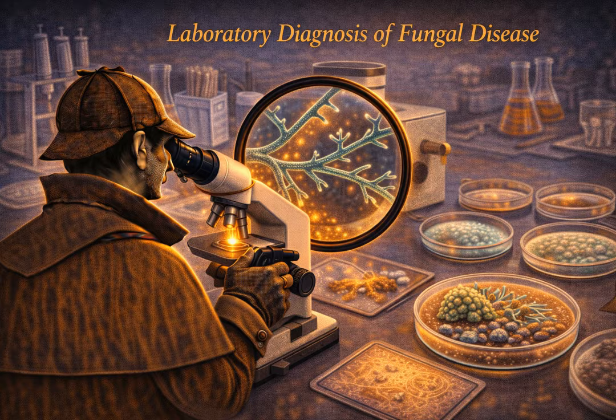So if you put it on a standard agar plate with just glucose, it won't grow, it just starves to death. Do you have to manually feed it fat? Literally. In the lab, if the doctor suspects Malassezia, maybe because the patient is spiking fevers while on lipid infusions, we will streak the blood sample on the plate and then overlay it with a layer of sterile olive oil. Olive oil, just poured right on top. Simple, cheap, but incredibly effective. If you come back a few days later and see tiny yeast colonies growing only underneath the oil slick, you have your definitive diagnosis. Malassezia furfur. I love that, the Italian dressing diagnosis.